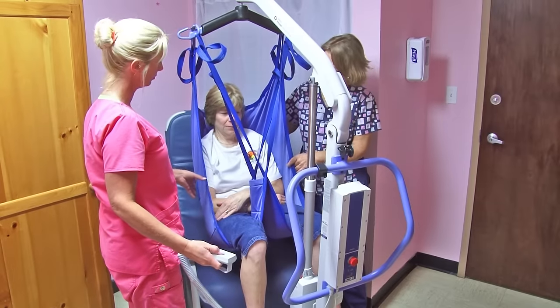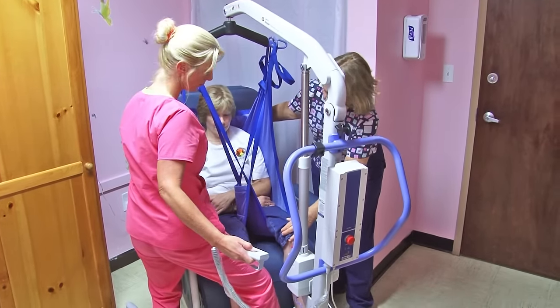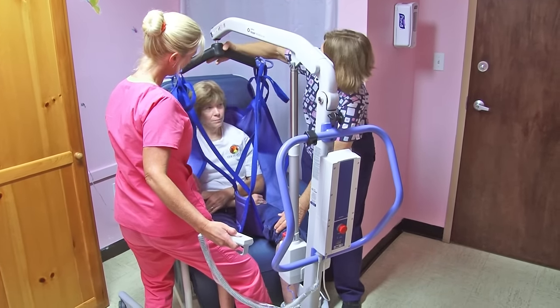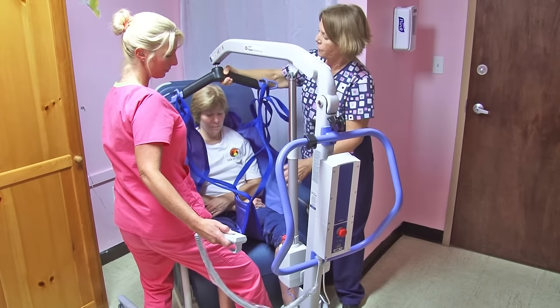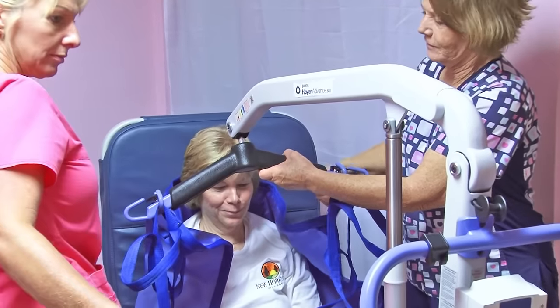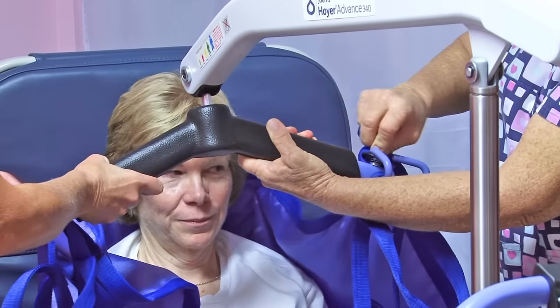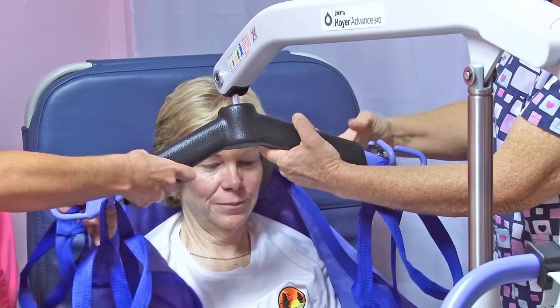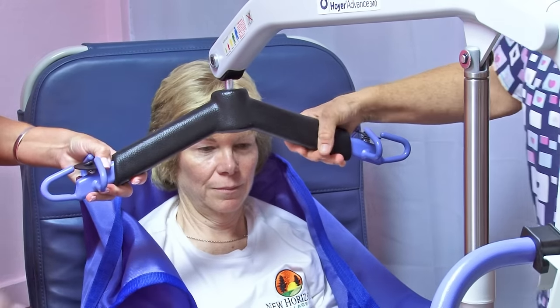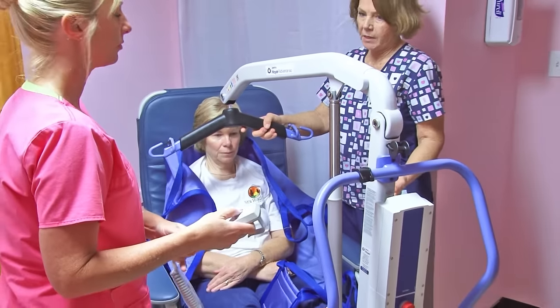We're going to lower you now into the Jerry chair. You can use your knee for support of the resident. We're watching here when we're lowering it to disconnect. You can stop there and then stop. Hold the bar while you're taking this off, or it's going to go into the person. Press down on the little tab as you're taking it off. Now we can raise to be out of the way.